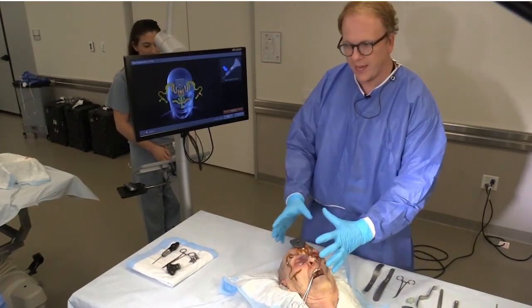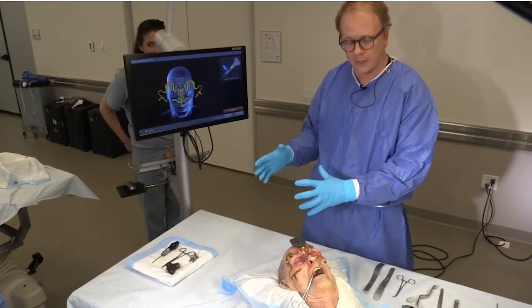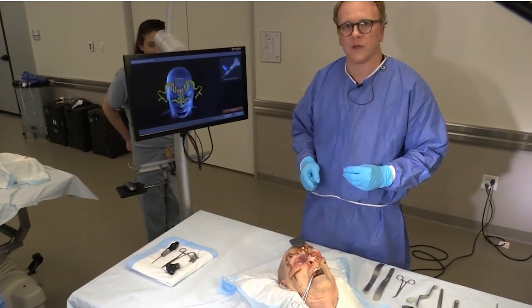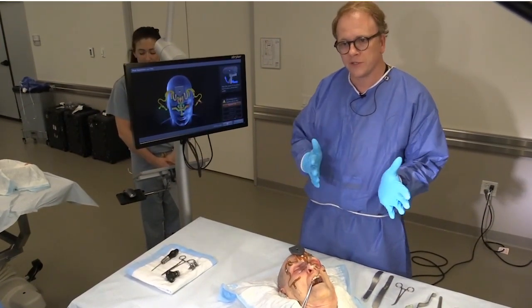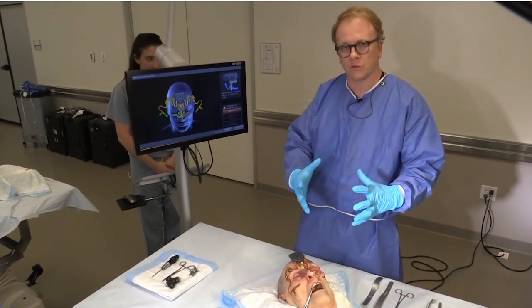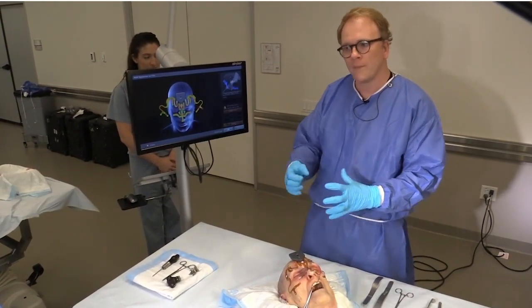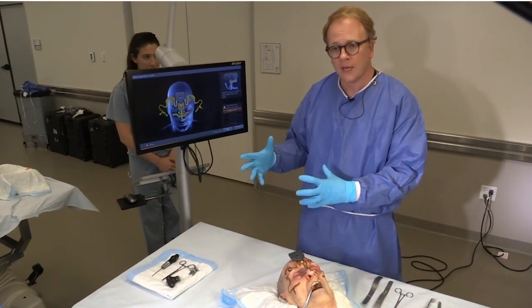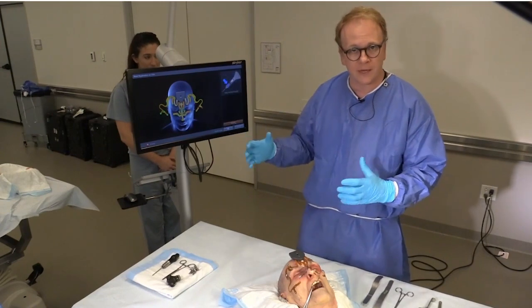When we do the registration, the data set from the face has to match the data set from the CAT scan very accurately. If a patient is very swollen when the CT scan is taken and the operation is delayed for a few days, the surface contours won't match — and that's going to make registration not very accurate. You need the data sets to match.